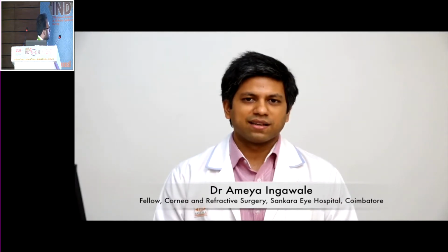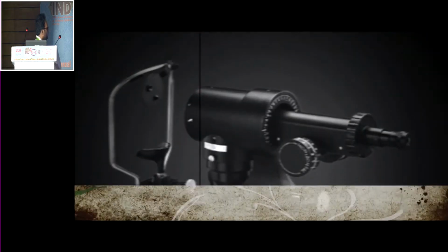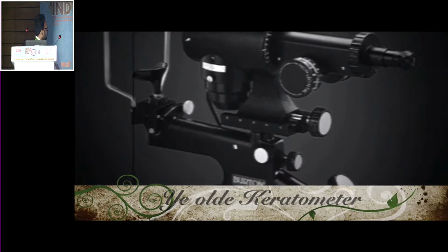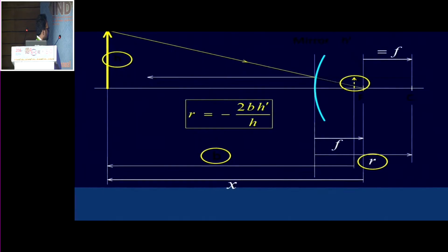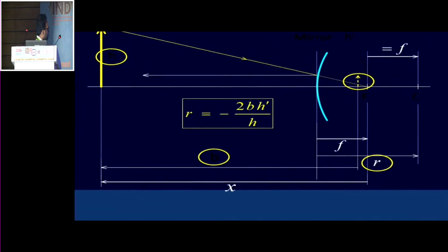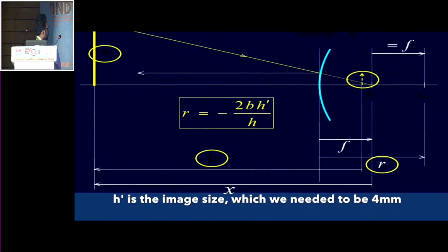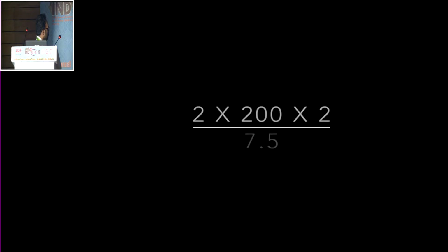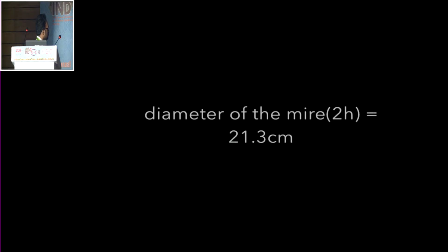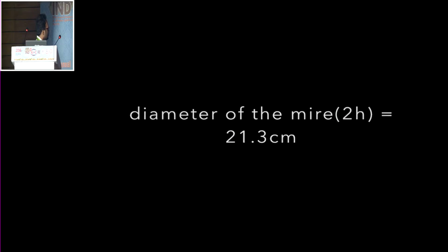Solutions don't come easy. We had to go back to our books, do the calculations, and do the math. Trial and error didn't work. To accurately get an image size of 4 millimeters, we turned to our loyal friend, the Bausch and Lomb keratometer, and its equation. R is the radius of curvature of cornea. B is the working distance of our microscope. H dash is the image size which we needed to be 4 millimeters. We had to solve for H, the size of the mire. We needed an illuminated ring of diameter 21.3 centimeters.